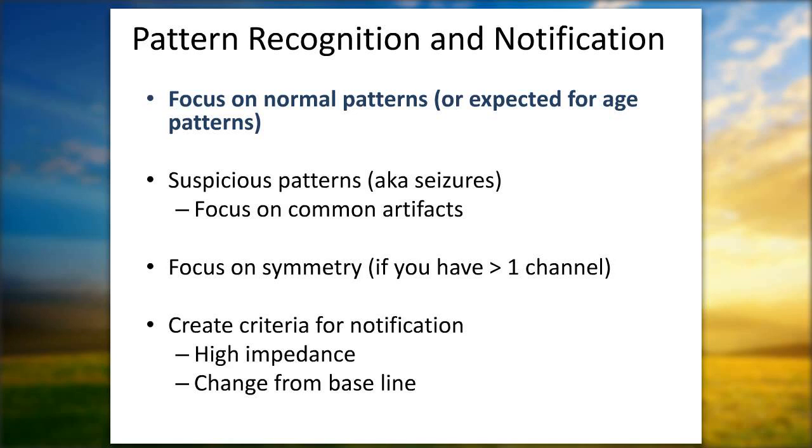So I think that without using aEEG, we should monitor, for sure. But to not cool a child who clinically meets criteria because the aEEG isn't fully showing the extent of injury, I think we may miss a few kids.